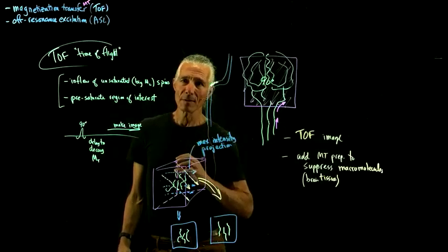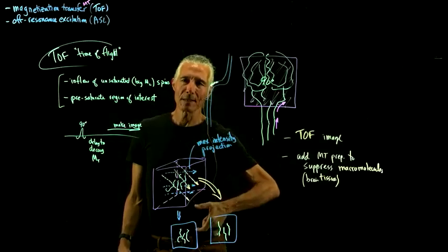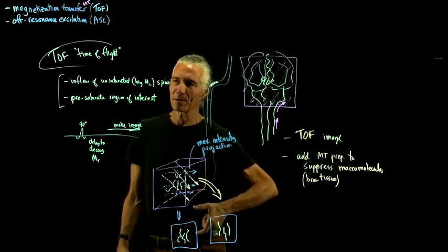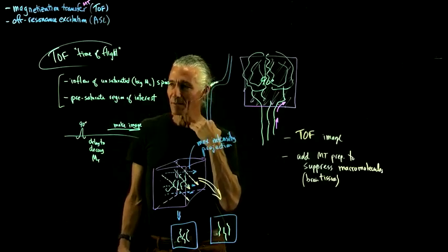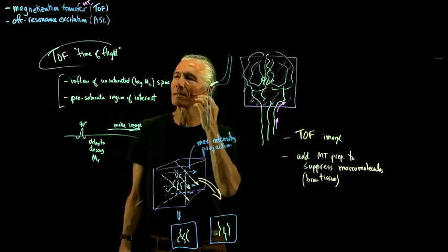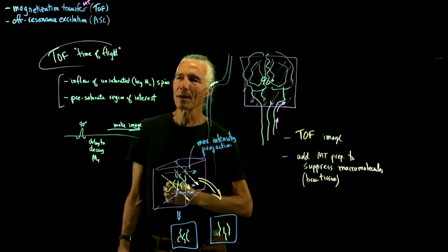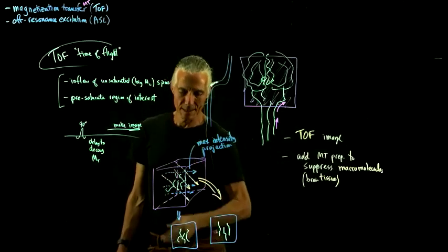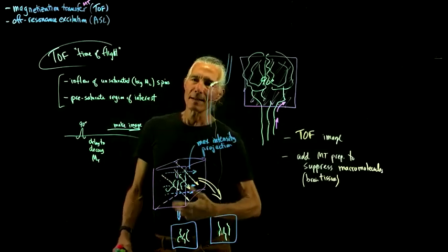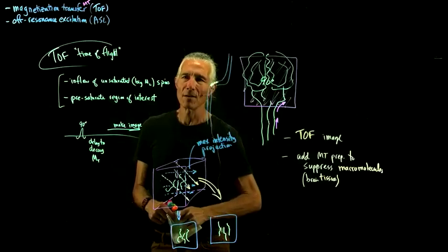But instead, what we could do is invert the spins, flip them to a minus Mz somewhere, say down in the carotid, and then wait for those inverted spins to flow up into the brain as they recover. So we could specifically label some spins on purpose instead of just relying on the fact that they're not saturated down there. That's how a perfusion scan works.